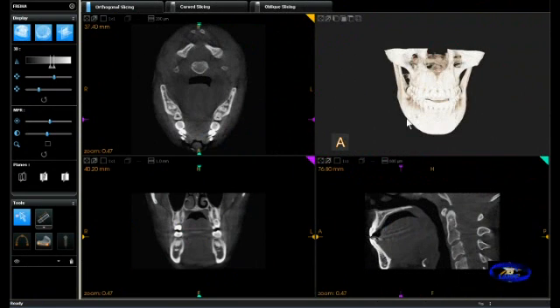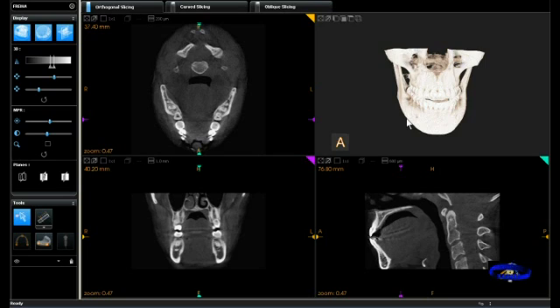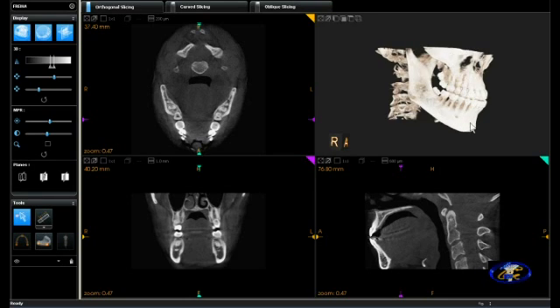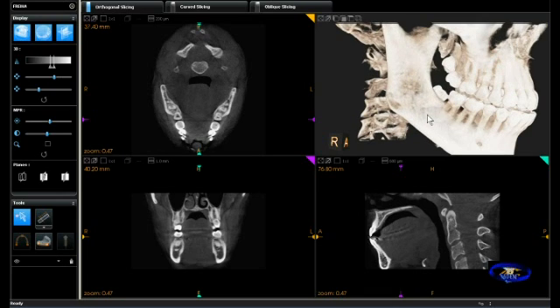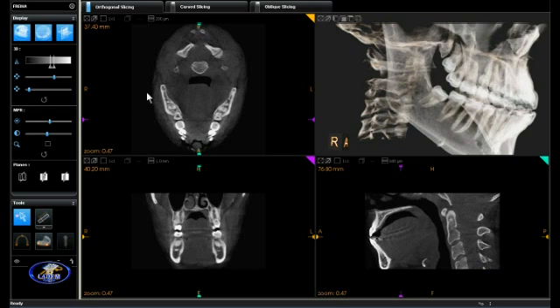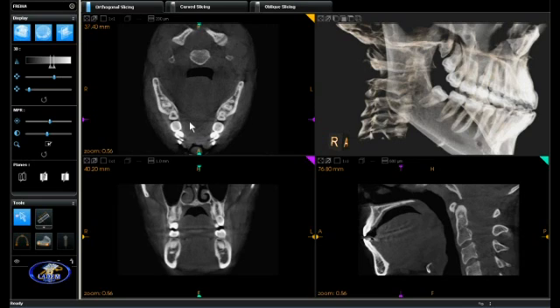This volume was acquired with the Kodak 9500 cone beam CT unit and is being visualized on Kodak Dental Imaging Software 3D module version 2.0. The purpose of acquiring the volume was to better understand the relationship of the patient's third molars to the nerve canal. In the upper right you'll see the volumetric view, and by increasing transparency we're able to see the roots through the bone.